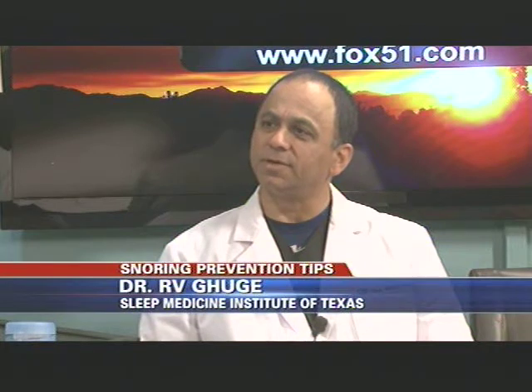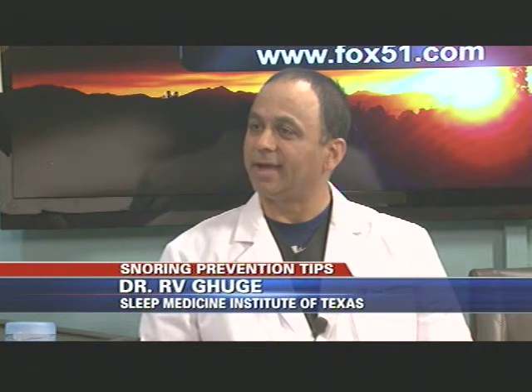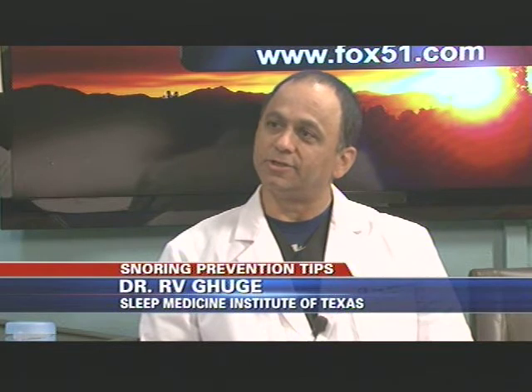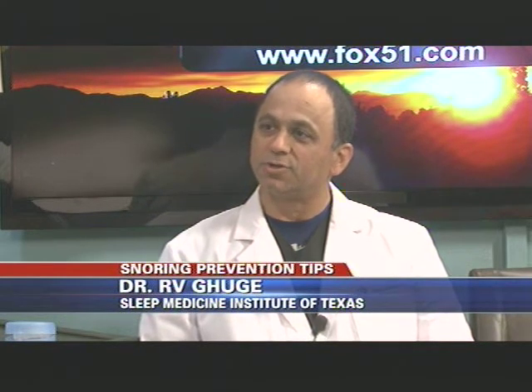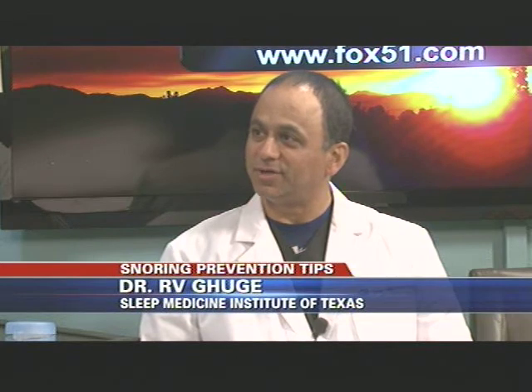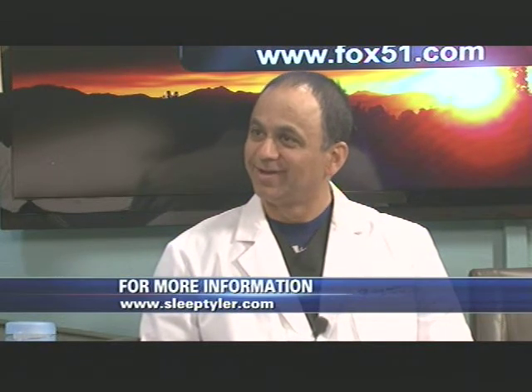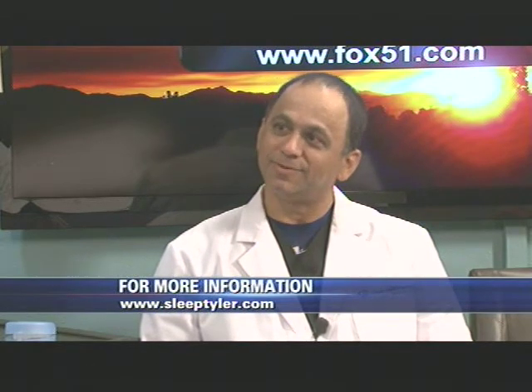That's a great question. When you do any intervention in medicine, you want to assess the effect of that intervention. And there is no difference when it comes to mandibular advancement devices or dental appliances. Typically when we customize an oral appliance, we do that in our office, and then we let the patient use it for several weeks, and then they come back and do a sleep test with it. And so we can identify if the apneas are completely controlled or not.